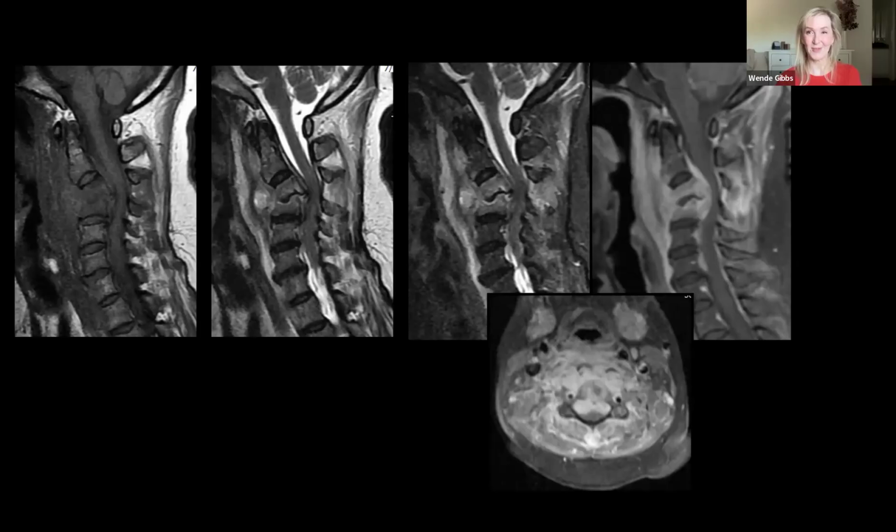That's the only difference that I know. Would you say that's the case? That's all I know about it. Typically I would call this phlegmon. When it's an abscess, it's usually, in my opinion, a peripherally enhancing capsule, and then you'll see this hypointense core.